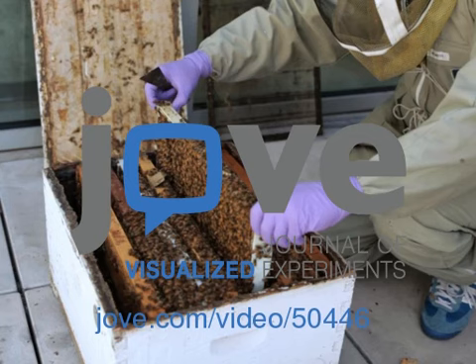The bees should look loose, not curled or contorted. Complete immobilization is important, as any movement could increase the size of the wound and mortality. Bees that are curled or contorted have been chilled for too long and should not be used because of high mortality.